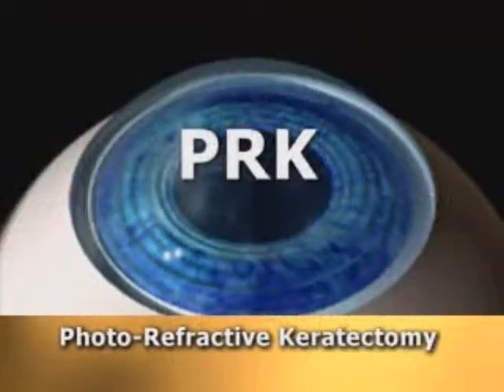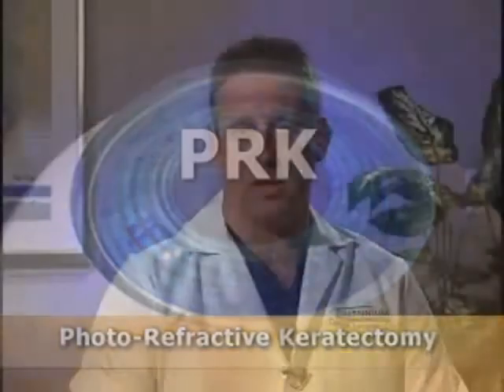Based on your history and the eye measurements obtained, we will be able to recommend to you whether reshaping the cornea on the surface or under a flap would be the best option for you. The original procedures approved by the FDA were performed on the surface of the eye and were called PRK, or photorefractive keratectomy. During PRK, the surface layer or epithelium is removed prior to treating with the laser.